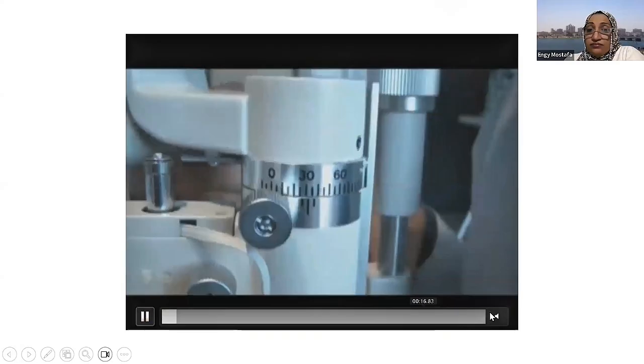Another point is that we see them moving. Why are they moving in that pattern? The ones in the anterior part of the AC near the cornea are moving downwards, while the ones near the iris are moving upwards. This is because it's warmer in the back near the iris, and when it reaches the cornea, it gets a little bit colder, so it goes down. So this is like convection currents. That's why they are moving. This is how we see it.